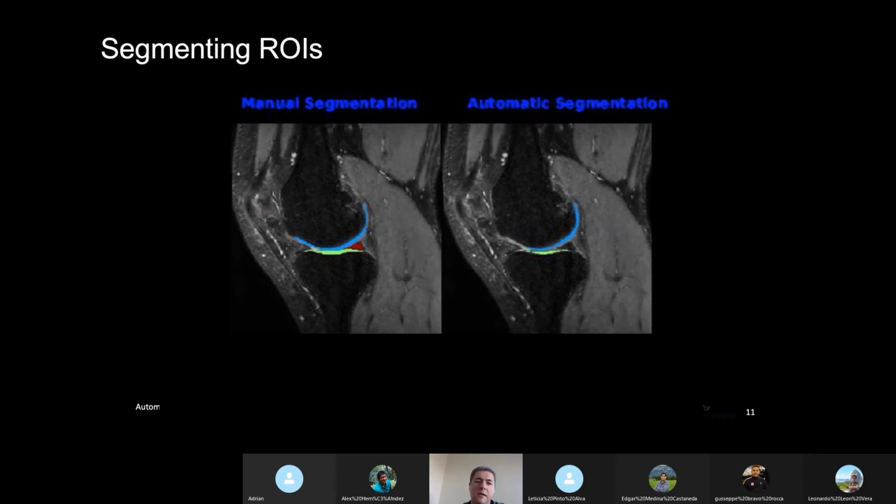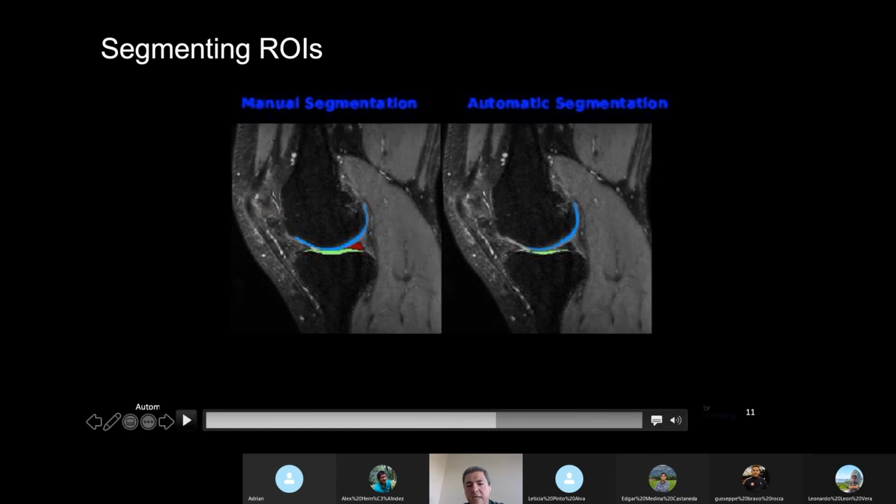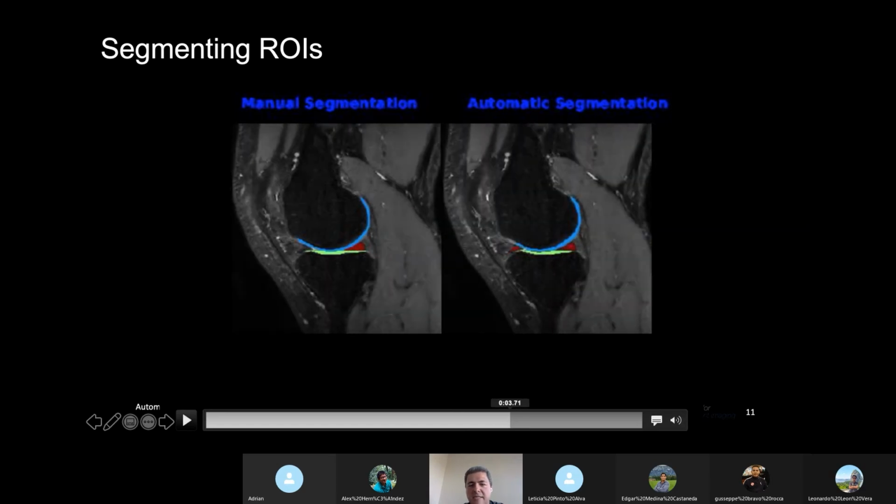I'm working on the continuous learning of this model to improve the segmentation and do the fine tuning of these details here and in the coverage as well. So we missed the meniscus completely in this slice. It takes a few slices for the meniscus to show up here.